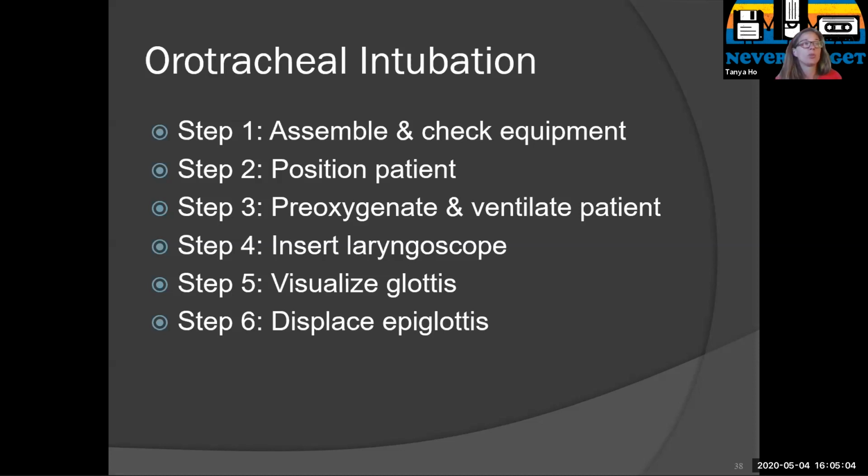Okay. So a lot of the time it's just setup and waiting for it to happen, and that takes most of the work. And then the actual procedure itself should take less than 20 seconds. Okay. So you're going to position the patient. The patient needs to be in a good position to maximize visualization of the vocal cords.